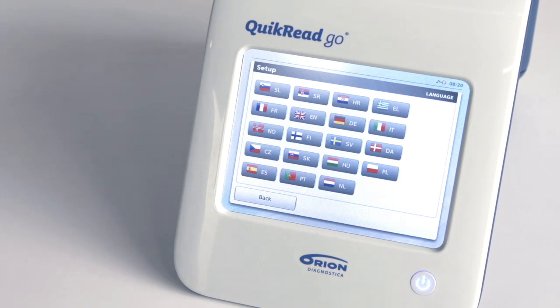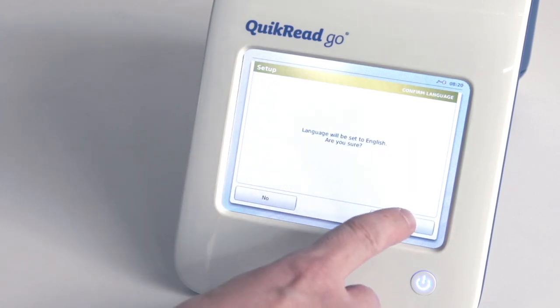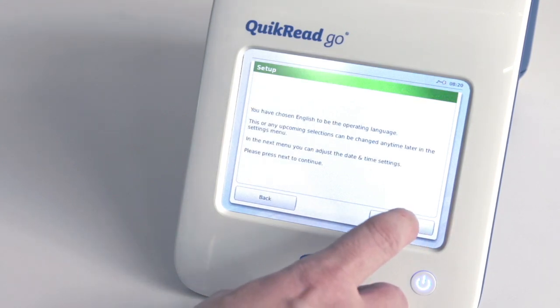The default language is English. It can be changed on the first step of the setup wizard. Select the language you wish to use by touching the corresponding language button and confirm your language choice. The chosen language can be changed any time later. Choose Next to continue.